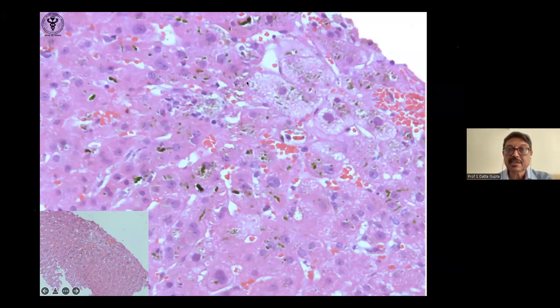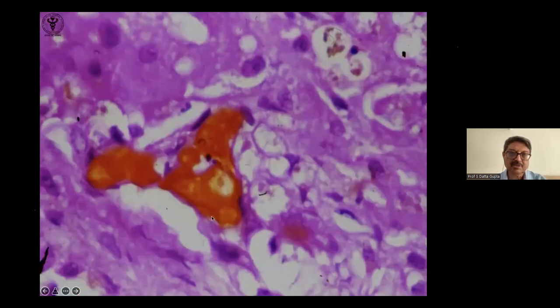Bile salts are toxic and cause ballooning, degeneration and necrosis of the liver, and that is called cholate stasis. So if you find this ballooning and other things with bilirubinostasis, it is mainly because of bile salts, which are toxic. It's called cholate stasis. The combination of cholate stasis and bilirubinostasis, which generally goes under the name of cholestasis, is a manifestation of biliary obstruction due to whatever cause.